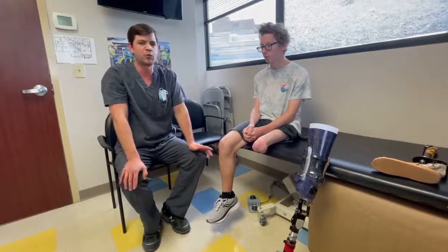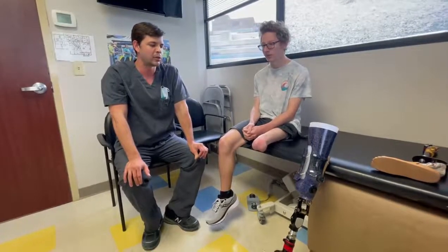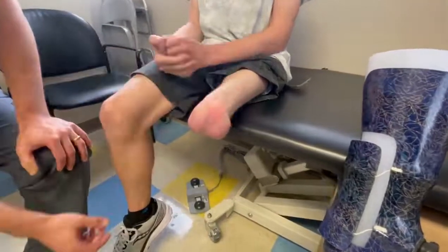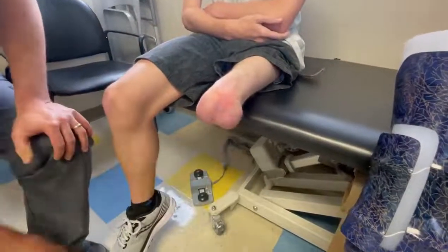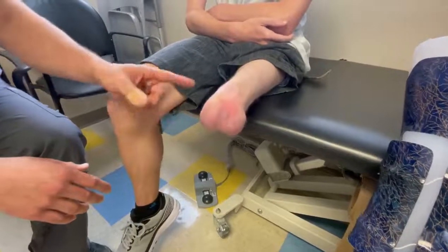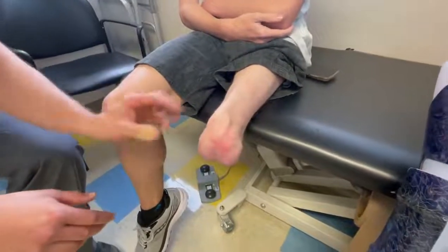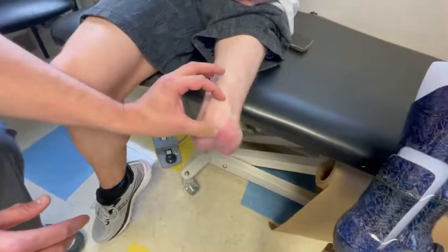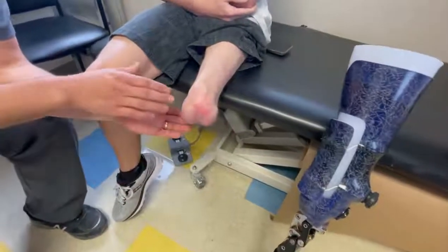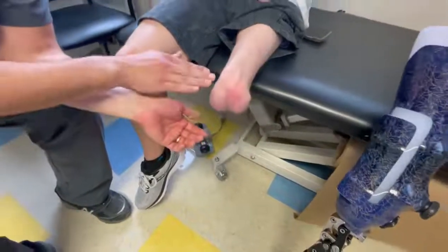Aiden O'Shea has a true knee disarticulation secondary to osteosarcoma, and as you can see, this is his residual limb. It is very bulbous distally — you can see the anatomy of the femoral condyles. He also has his patella in here. He's moving his muscles and his patella has been left intact. A lot of times when you leave the patella intact, patients cannot really tolerate the bone-on-bone contact between the patella and the femoral bone.